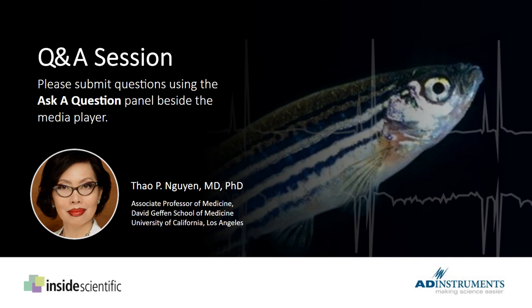What we go over today is induction. We didn't even go into maintenance. We don't need maintenance for a short session. They're pretty quiet. But you point out a really good point. That's the kind of bullet you have to bite. You have to do the balancing between taking the toxicity, which means the depression of cardiorespiratory functions, versus controlling for motion artifact. Otherwise, the ECG is not interpretable.